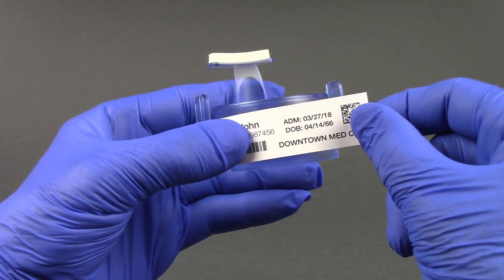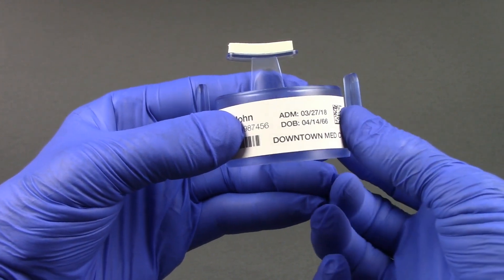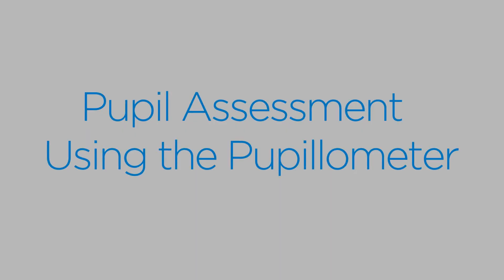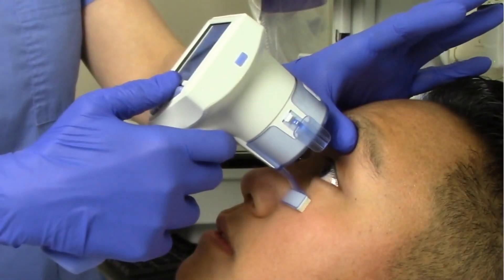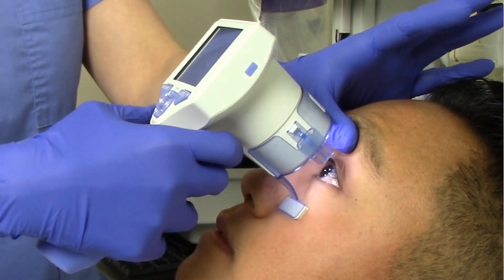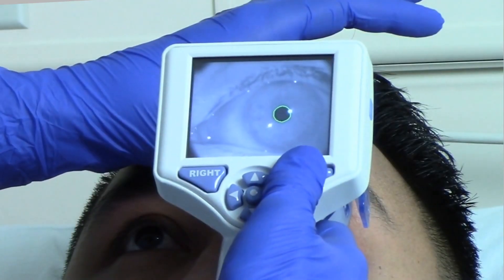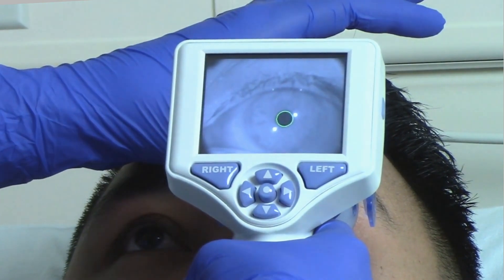We recommend placing the patient ID label directly on the smart guard and keeping the smart guard at the patient's bedside. To begin the measurement, position the smart guard at a right angle to the patient's axis of vision, minimizing any tilting of the device. Remember, the pupilometer right and left buttons are oriented to the patient's eye being measured.